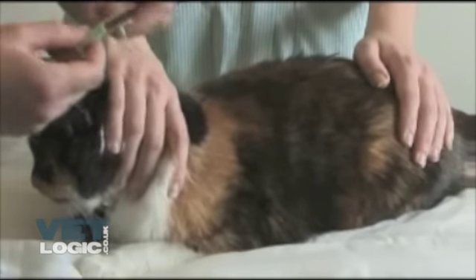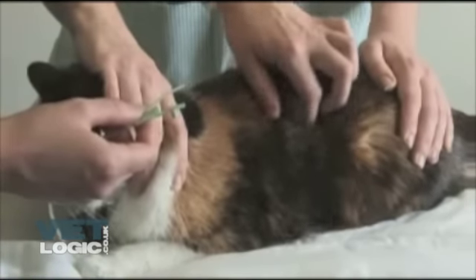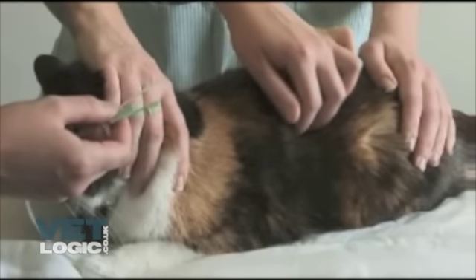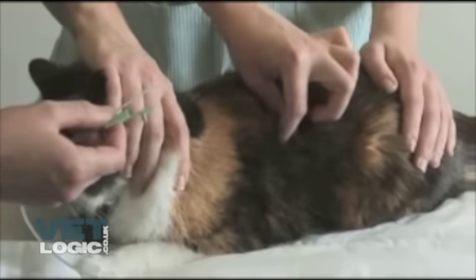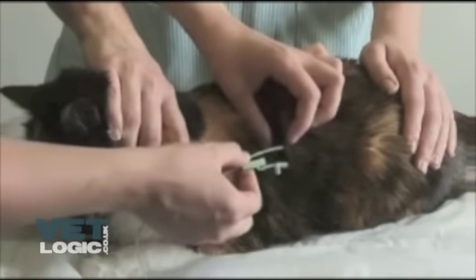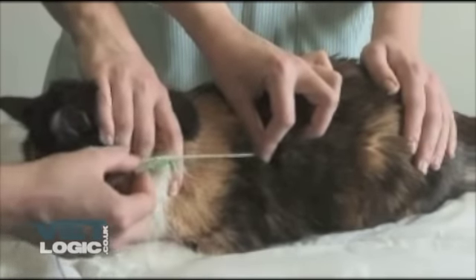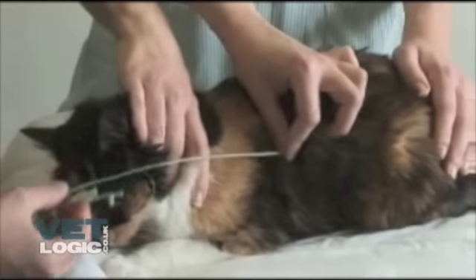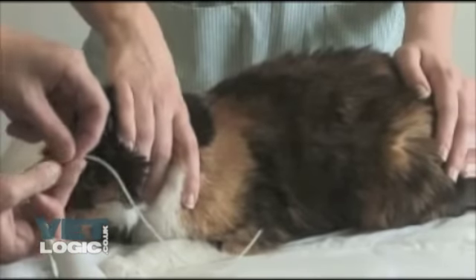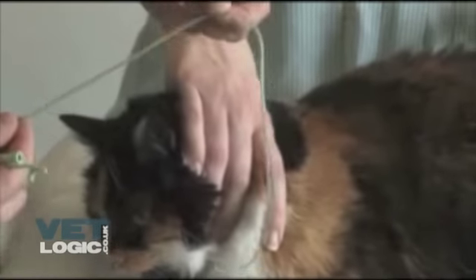When in place, the nasoesophageal tube should lie in the distal esophagus. The tube should not enter the stomach, as this will cause gastric reflux due to the tube passing through the cardiac sphincter. Therefore, the tube should be measured to approximately the ninth rib. This can be done by counting backwards from the last rib as demonstrated.